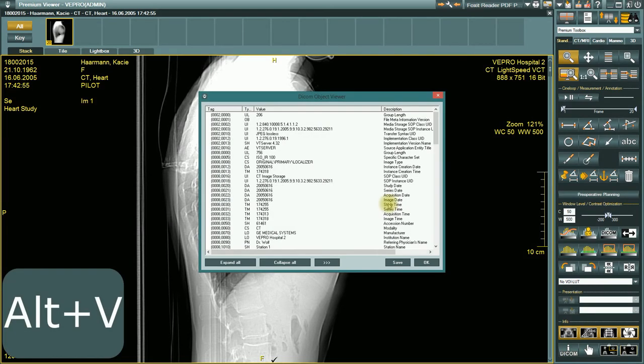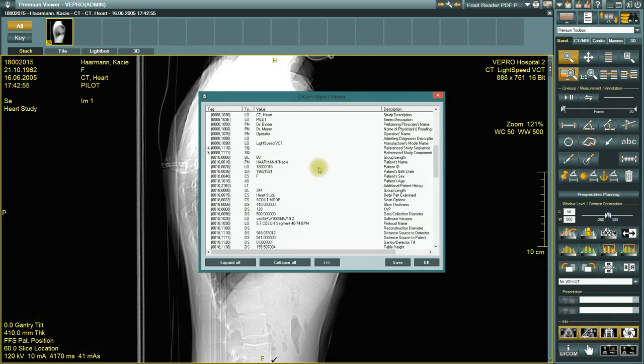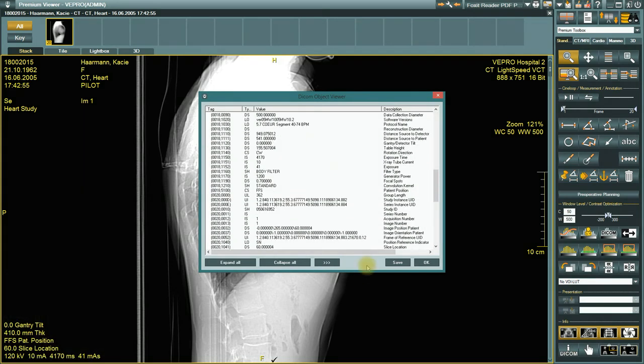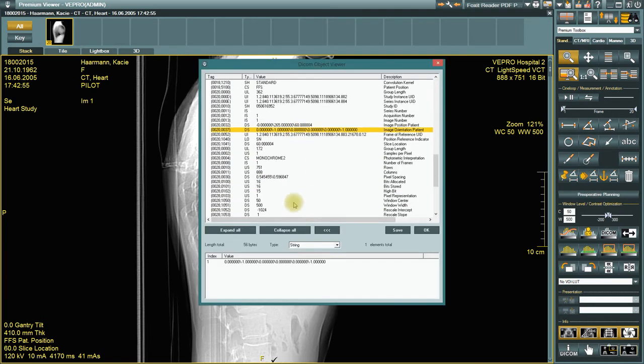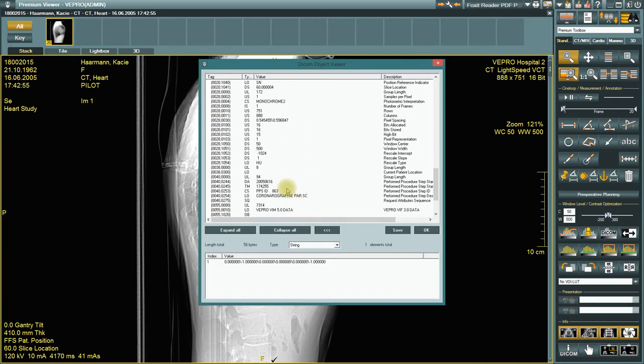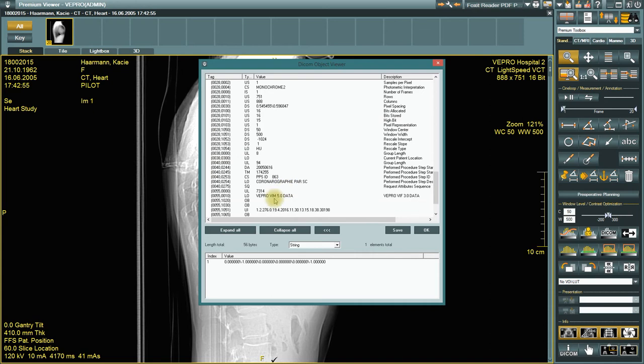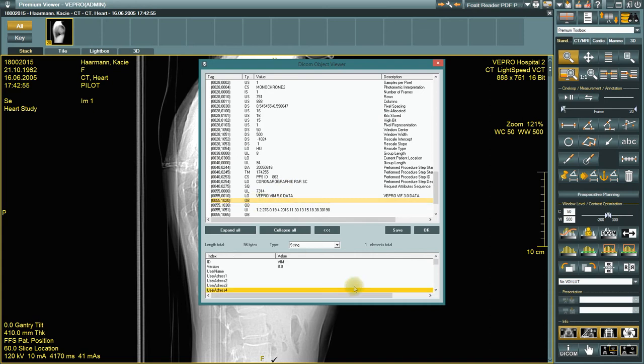These image descriptions can be displayed in a list by using the DICOM information button or the displayed shortcut key. The conditions, layouts and labels for this can then be configured in the hanging protocol editor. The DICOM data contains public tags and private DICOM tags.